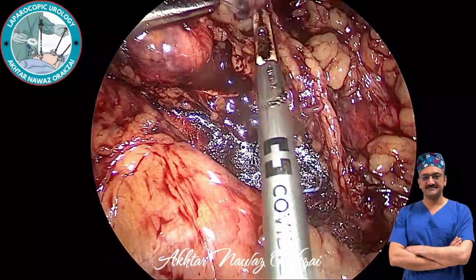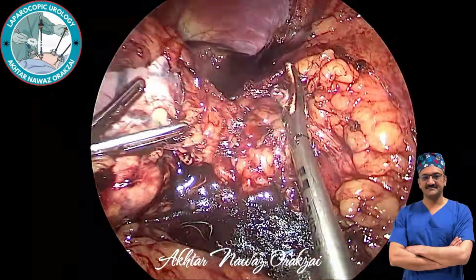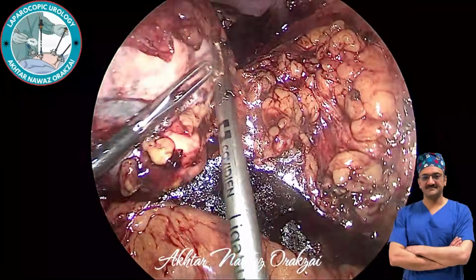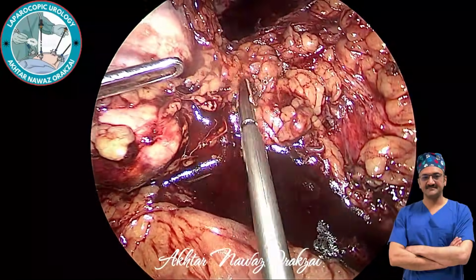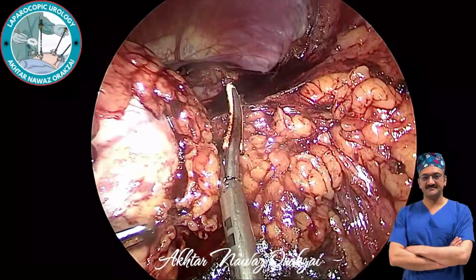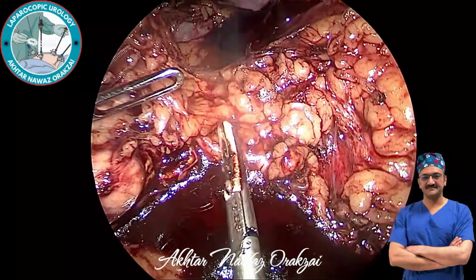So the pressure in the renal vein is of course not that much like that of the IVC, because IVC has got a bigger lumen, contains more blood, so any injury to the adrenal vein on the right side would be considered bleeding of the inferior vena cava.